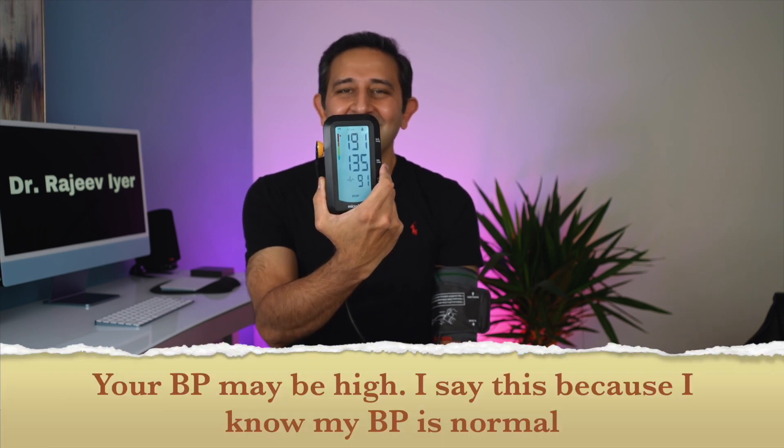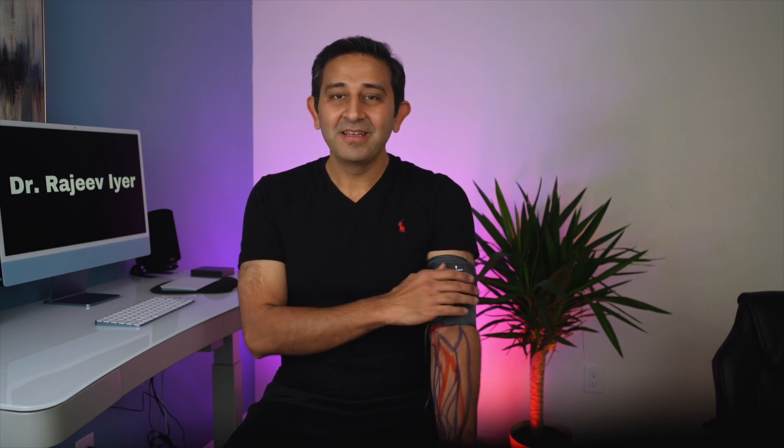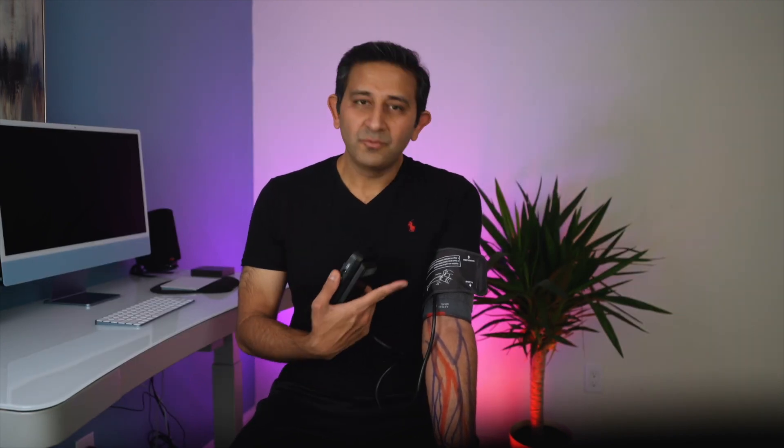That cannot be real — there is some error in the measurement. I'm not going to panic on this number, but I'm going to check again. When you get an inaccurate reading, just take the cuff off, put it back again, make sure all connections are fine, and then recheck. So hit the start button again. Here is my blood pressure — I like this number much better. This is a practical problem: you can get inaccurate readings, so repeat it again or use the cuff on someone with normal blood pressure to verify.